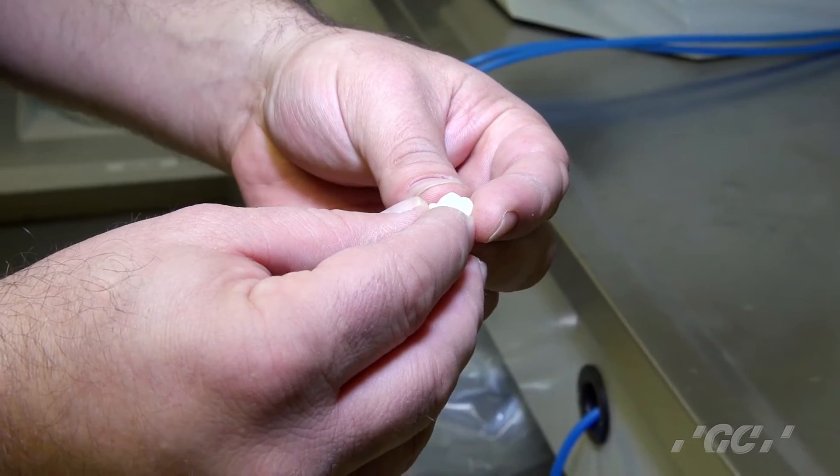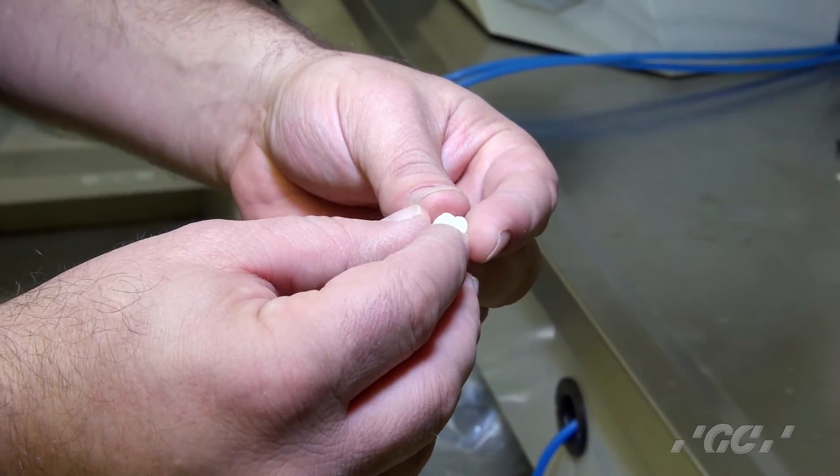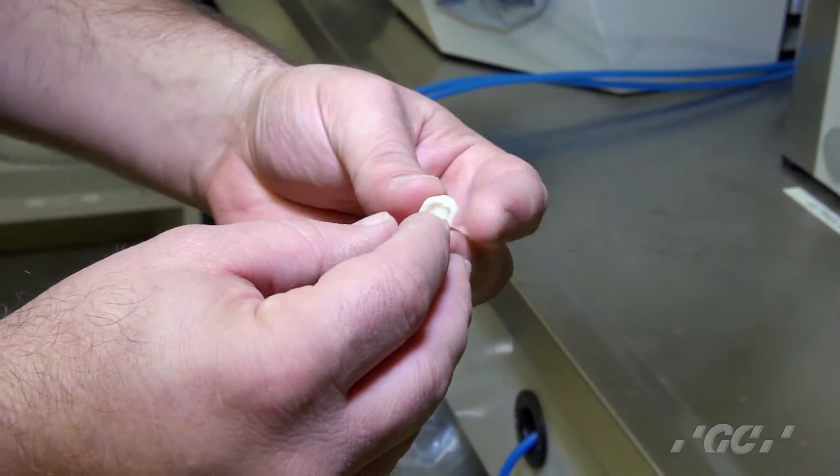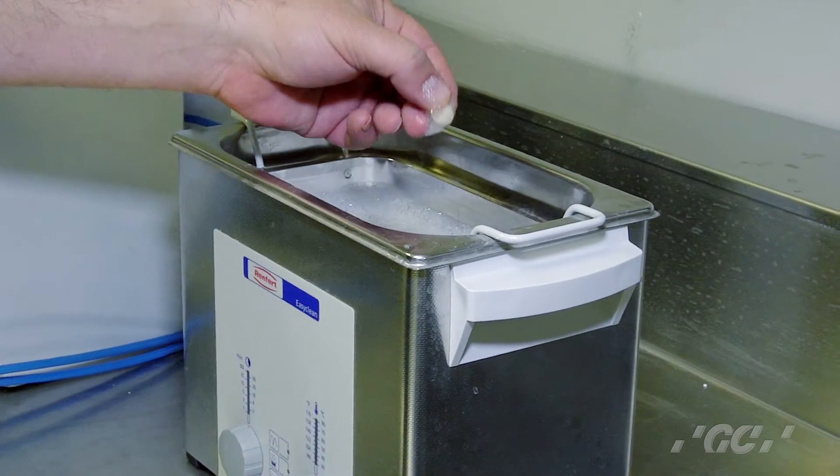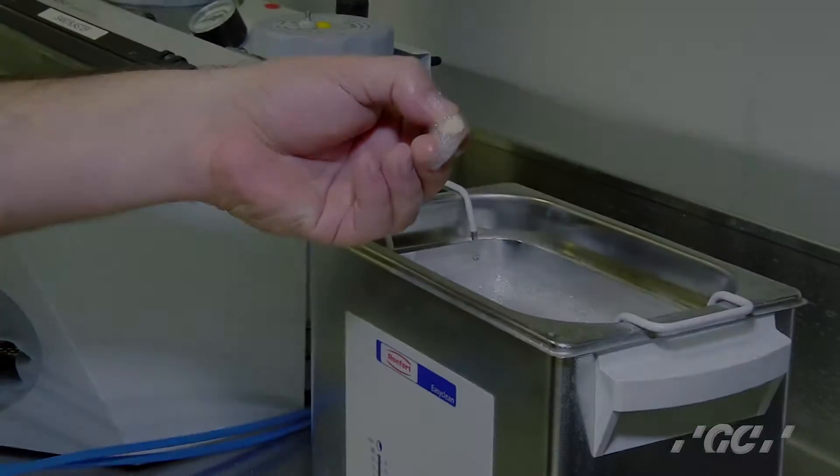Now we're going to take the Cerismart restoration and put it in the ultrasonic cleaner to make sure we get rid of any debris that's left over. When that's done, we're going to take it over, wash it off, and get ready to apply the OptiGlaze.